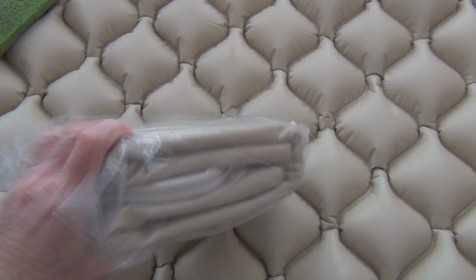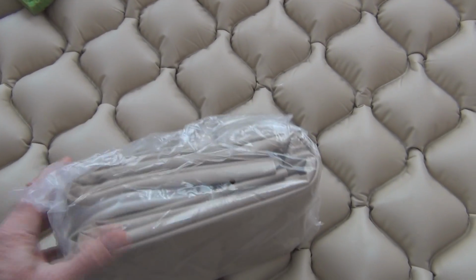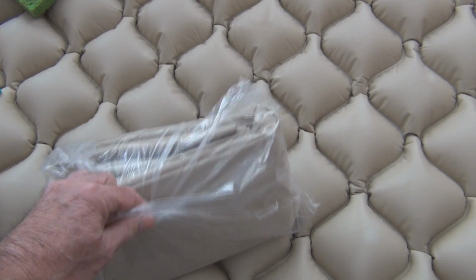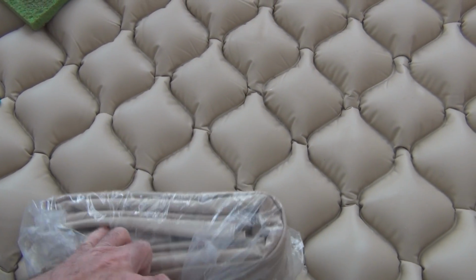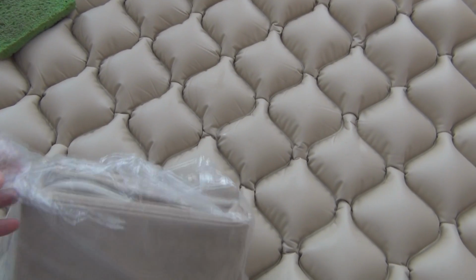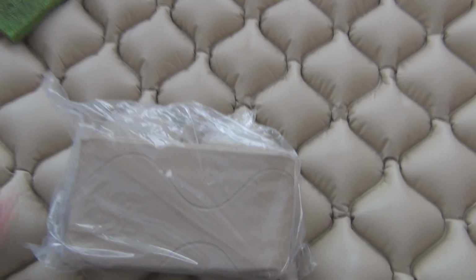And it's all nice and compact. And even though it's pretty heavy duty vinyl, these are alternating pressure chambers, with the air pressure on 24/7. So it's eventually going to spring a leak, especially when you have an individual with weight on it also. So let me go ahead and take this out of the bag and take the old one off.